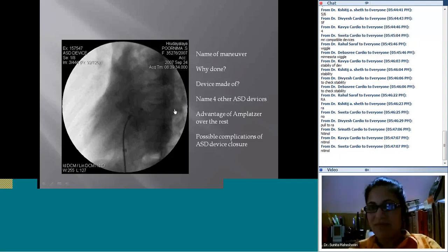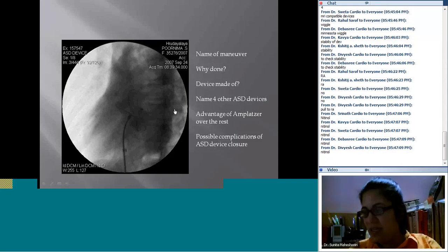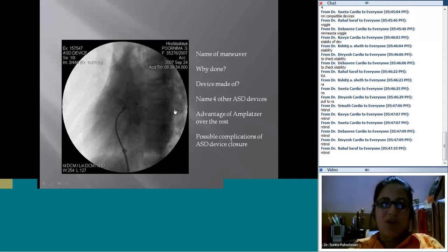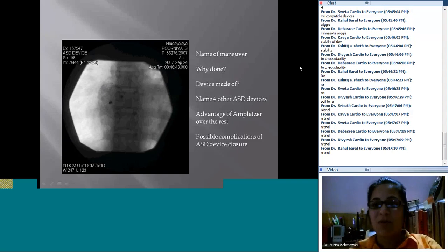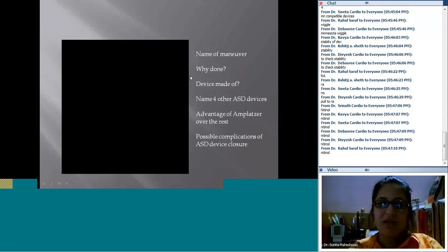Okay, quickly, name 4 other ASD devices, all 4 in a row. Don't give me one by one.